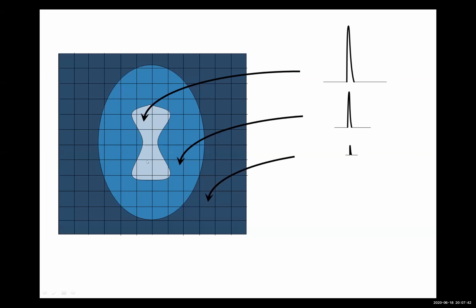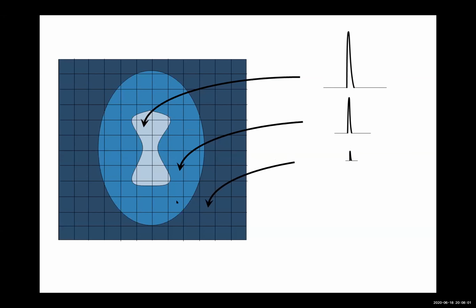Usually, pixels will be represented by a single unit shade of gray. This means it can be either white or black or one of the grayscale levels. This is wrong, but it's just for simplicity to show you what we mean. Usually we will not see any pixel that is half bright and half dark. Usually the average signal will be represented. So in this example, we will have a dark and bright, so it will be gray, for example, and then we will represent that pixel with a gray.